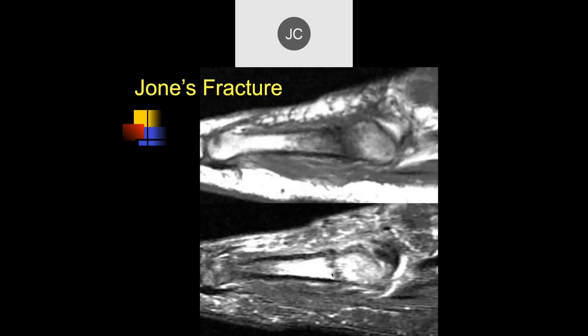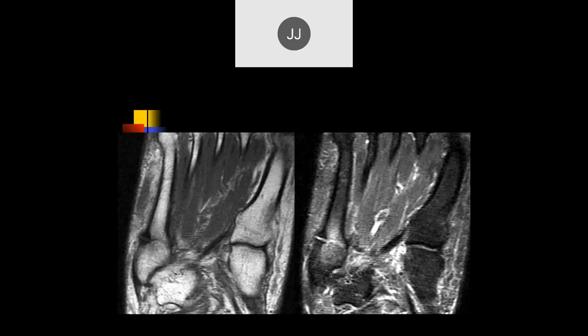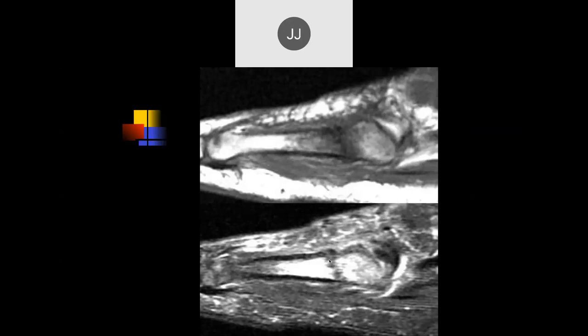This case may be more chronic — we don't see nice sharp margins; they're kind of irregular. We see eburnation on either side and no clear fracture line, which looks more like stress fractures seen elsewhere in the body. Some believe more metaphyseal fractures have a worse prognosis than diaphyseal fractures, but in clinical experience, both are high-risk lesions. Campbell considers a Jones fracture to involve the superior margin of the metaphysis at the joint line. The bottom line is that treatment is pretty much the same for both.